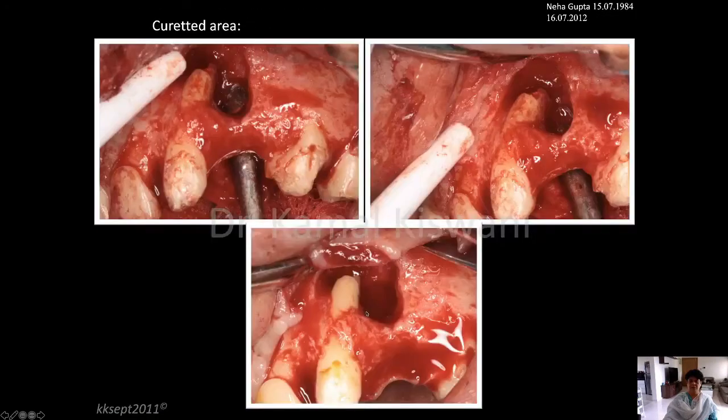and the soft tissue was inside. We cleaned the soft tissue around the entire region. And this photograph was purposely taken because this instrument, the periosteal elevator, has gone parallel, and from the buccal window you can see the periosteal elevator. That means that the palatal dehiscence, which was seen, also is present, which needs to be taken care of.